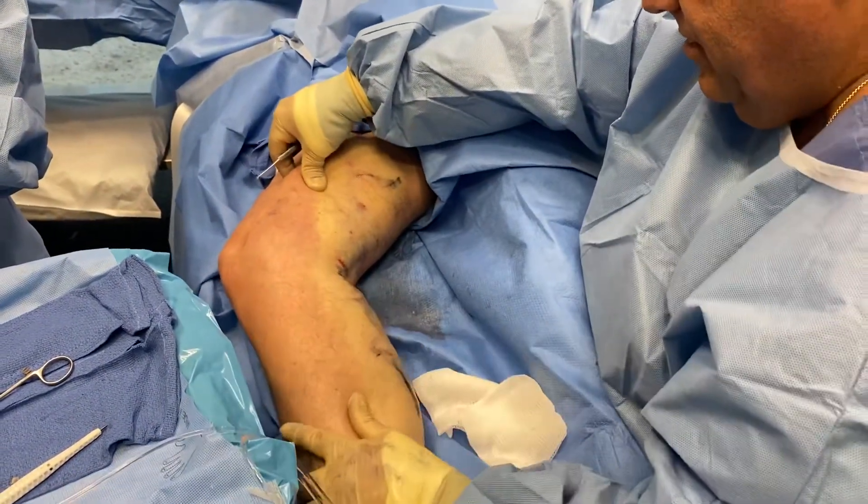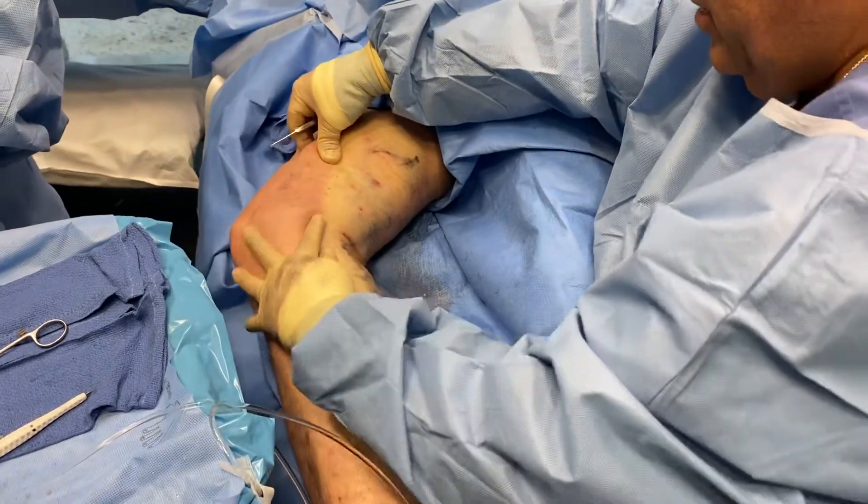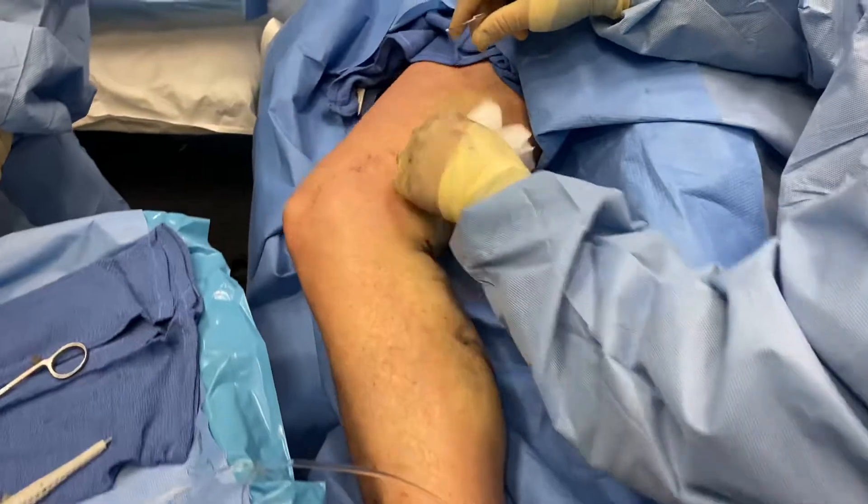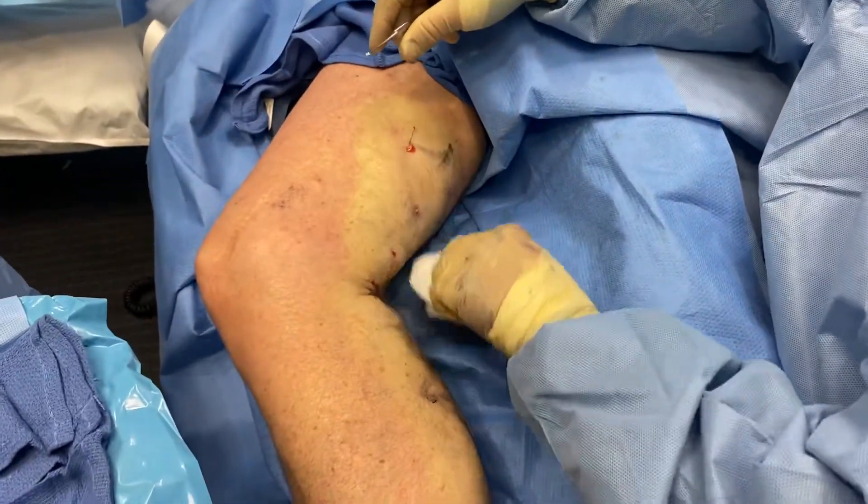Today Dr. Bonavita is doing what's called a minimal phlebectomy, or ambulatory phlebectomy. The procedure consists of numbing a little bit, just gently under the skin.